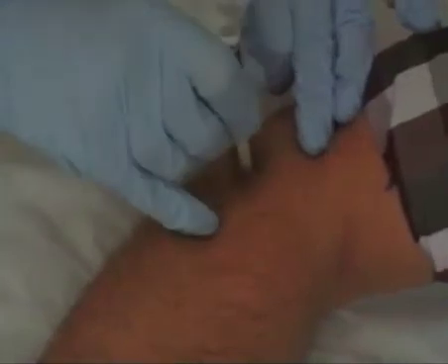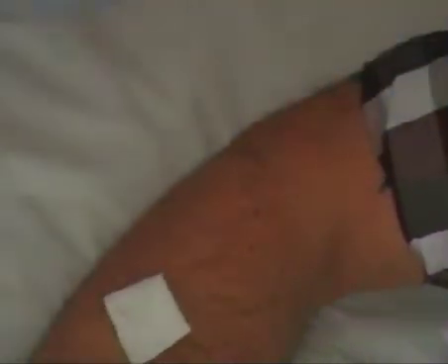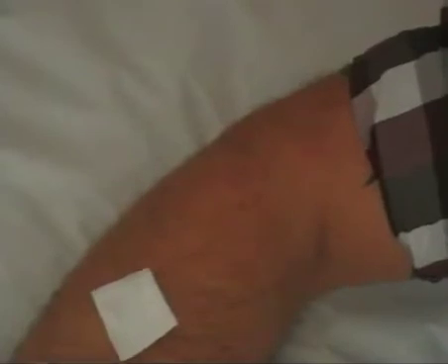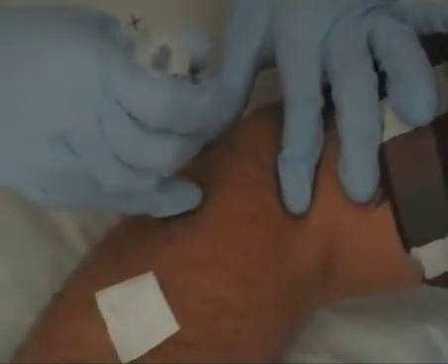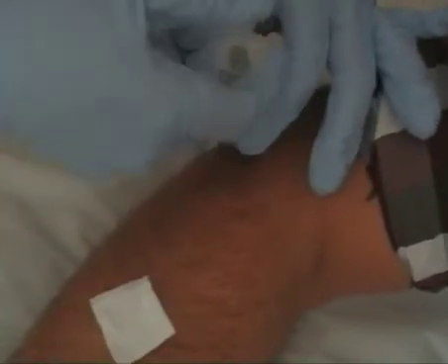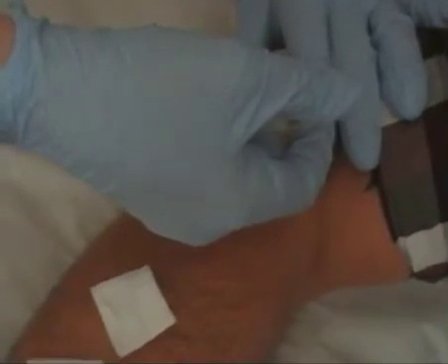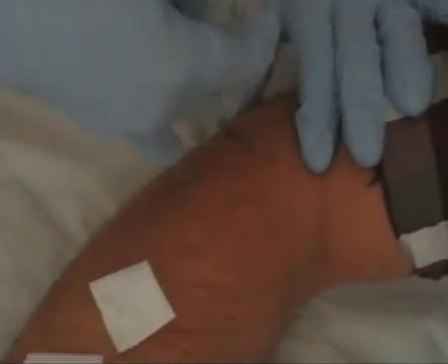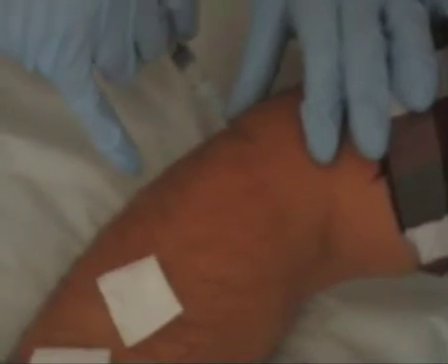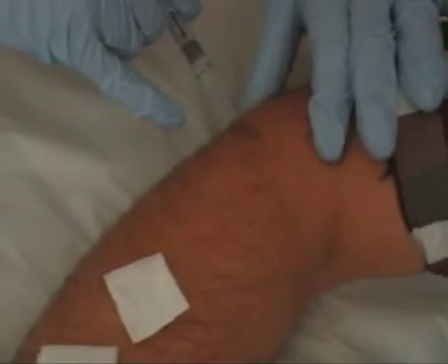We've marked the patient's skin on the common extensor origin. Now it's important to clean the area thoroughly. Sharp scratch. We go in at 45 degrees to the point, and as we retract a little we bring it round and administer 50% of the drug. Then we take it round through the arc and in, and as we retract we put the other 50% in and finish.